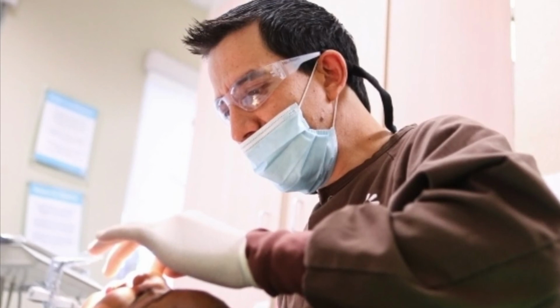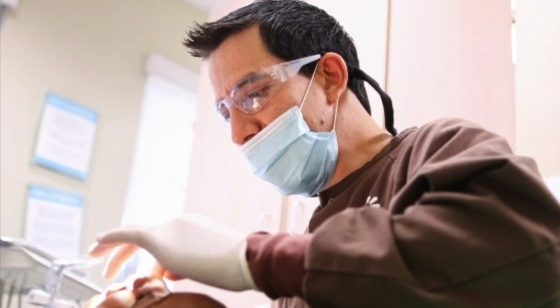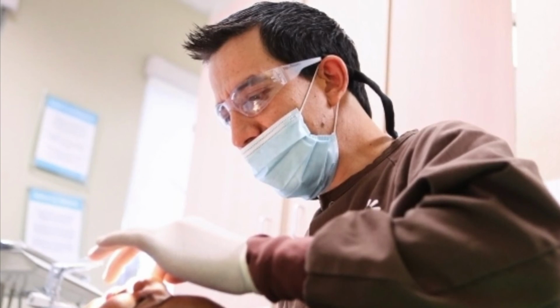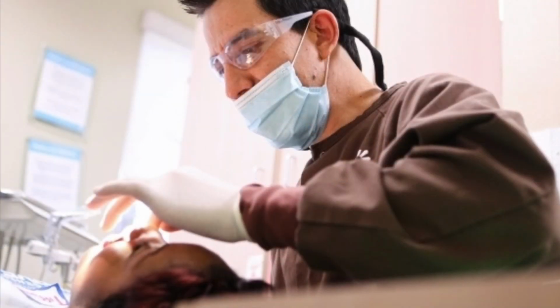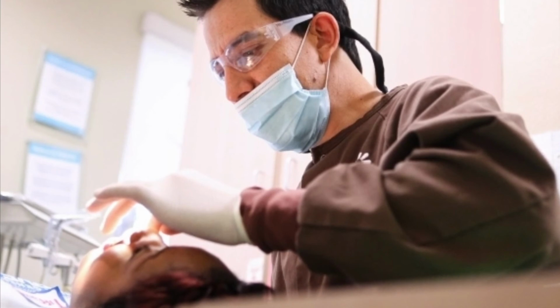Next, the K-type instruments and the K-reamer. Both are the oldest useful instruments for cutting and machining dentine. They are made from stainless steel wire that is ground to a tapered square or triangular cross section, and then twisted to create either a file or a reamer. A file has more flutes per length unit than a reamer.